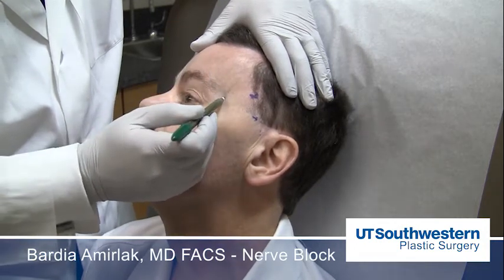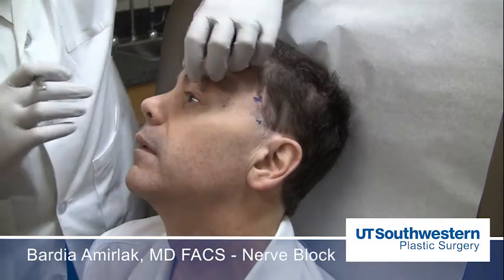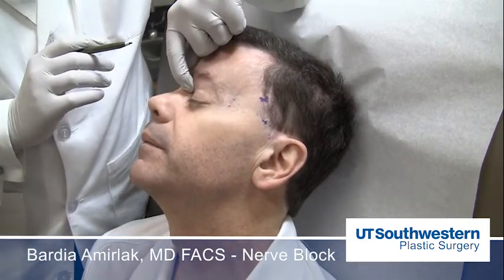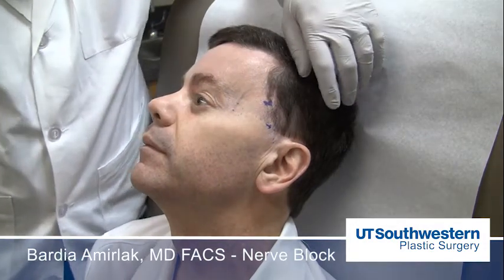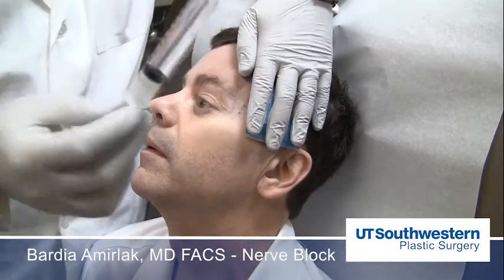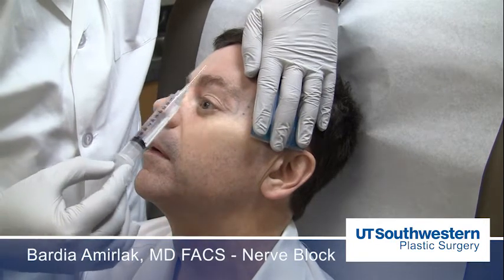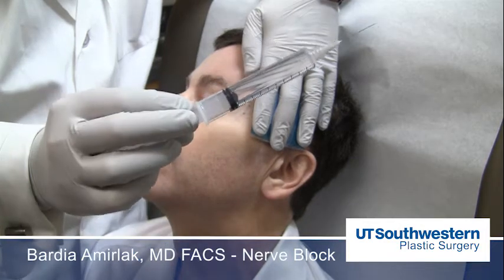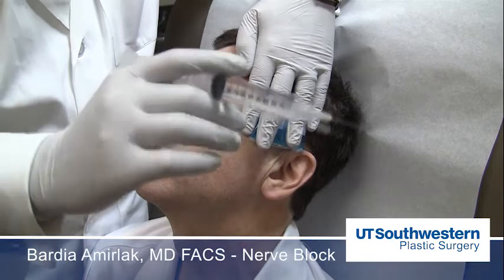You want to give a diffuse injection right where that tubercle is. The supraorbital, which is usually tender, and the supratrochlear need to be addressed individually. I don't mark these in advance. Ice always helps, and all my injections in the forehead use 27-gauge long needles. Alternatively, you can use a 30-gauge to start in the brow if the patient has a lot of tenderness.